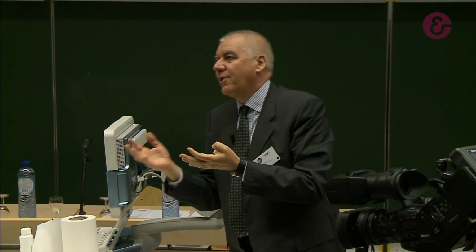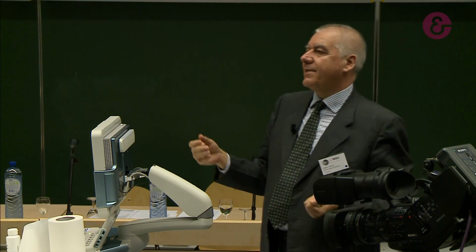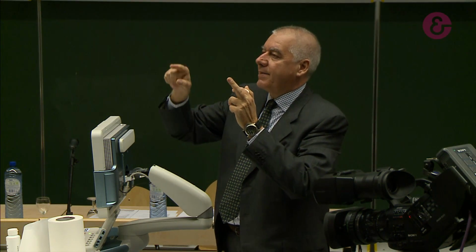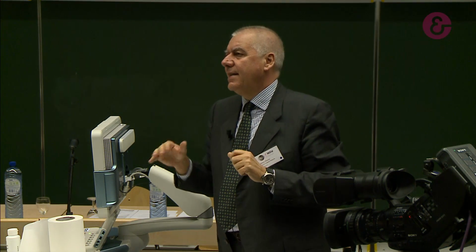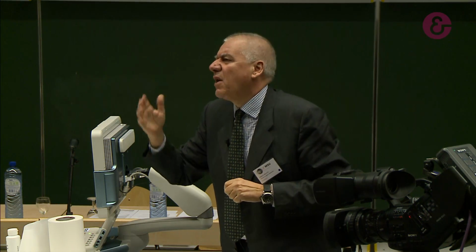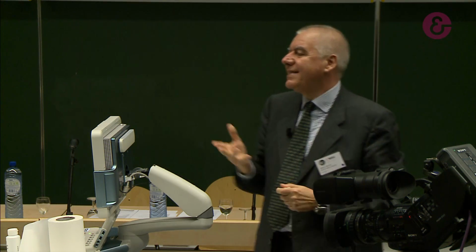I understand it's not very scientific, I understand. But you know, if you start to measure, you never know if you have to measure the outer part, the hyperechoic part, yes or not. There is a lot of confusion about that. The size, the shortcut value, differs a lot also. 14, 50, it's very difficult.